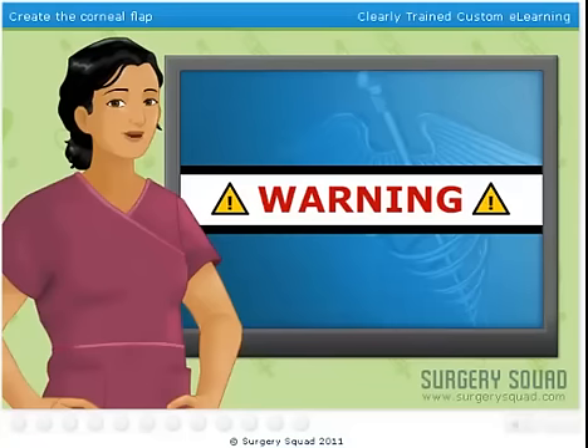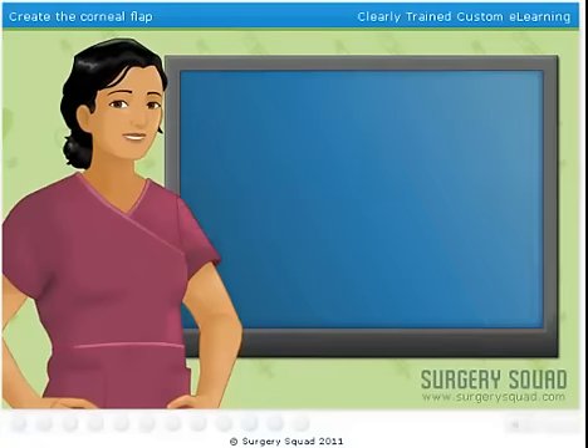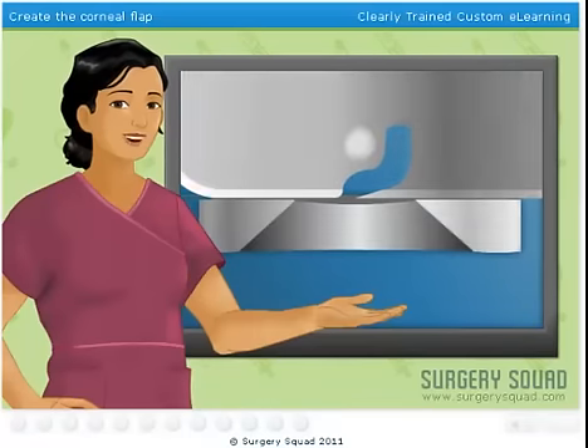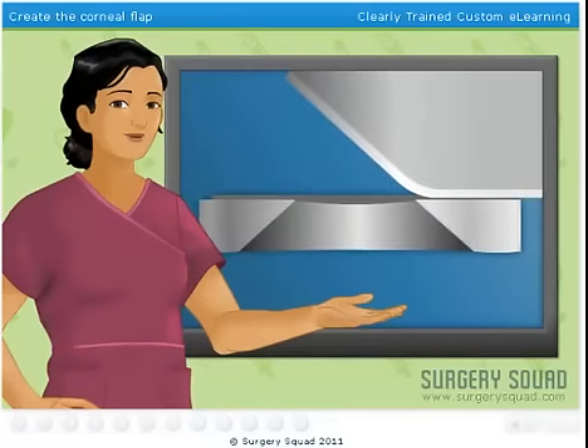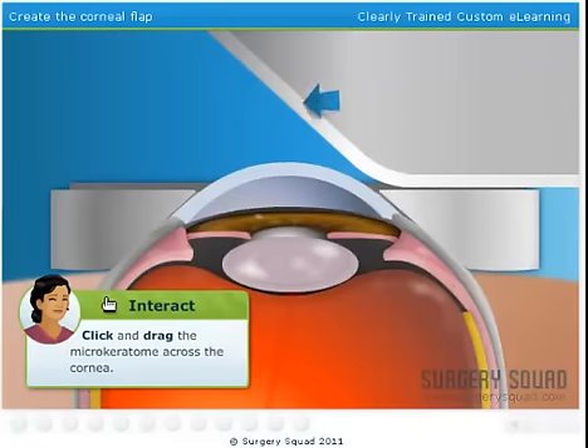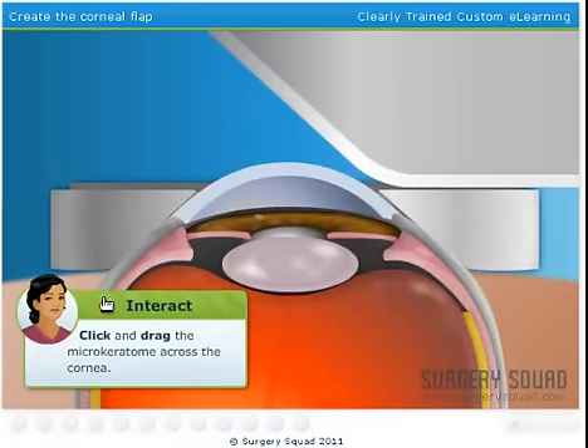For this next step, we're going to slice open a flap on the cornea. To make the corneal flap, we use a mechanical microkeratome. This is a fancy name for a blade device that's attached to the suction ring — we slide it across and it cuts the top 20% of the cornea. Slide the microkeratome along the track to create a thin flap in the cornea.